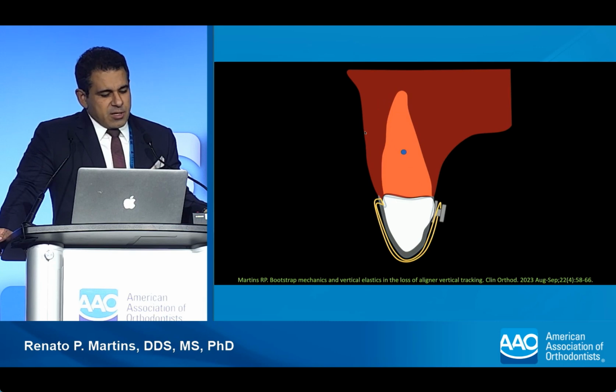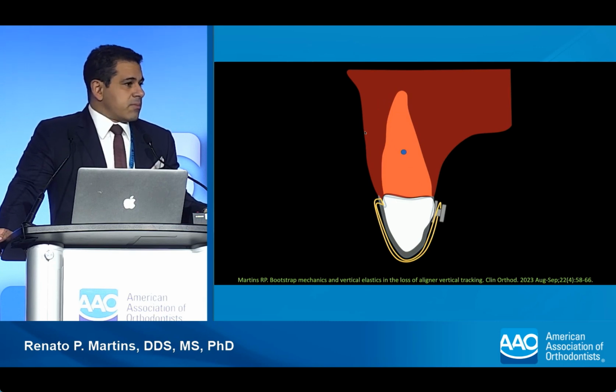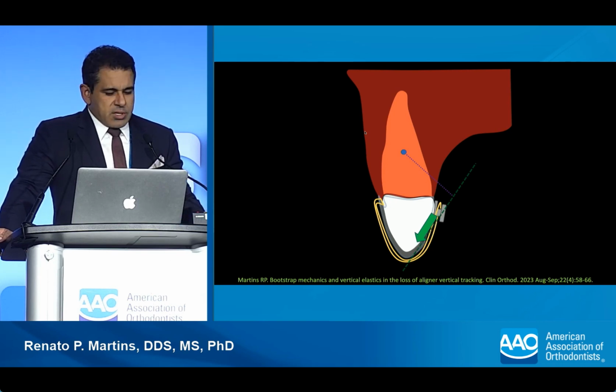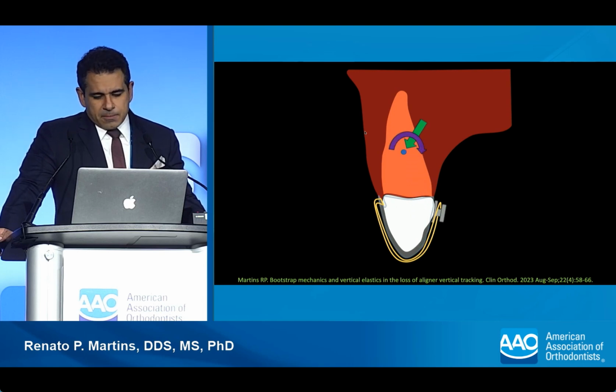A better idea is to use it lingual going buccal. So you bond the button on the lingual aspect of the tooth, because then the load system is going to pull the teeth away from collision. And that, for me, is a better idea.